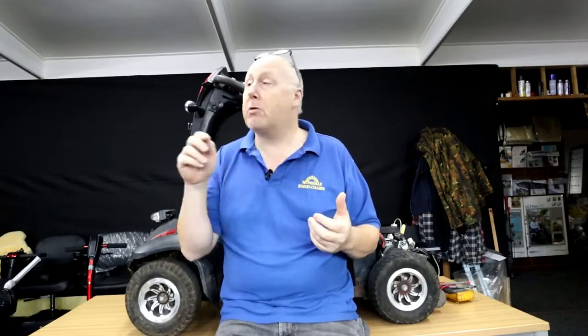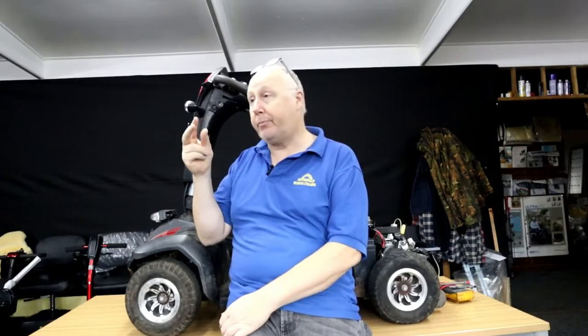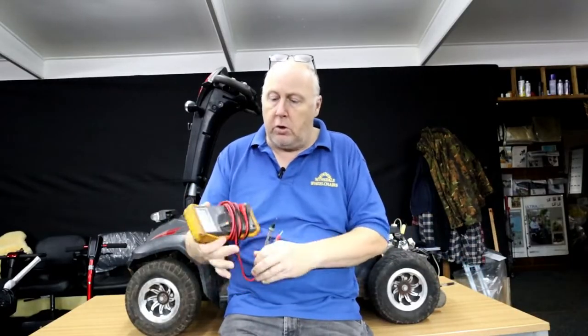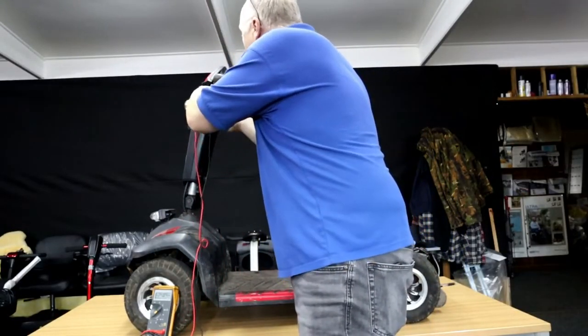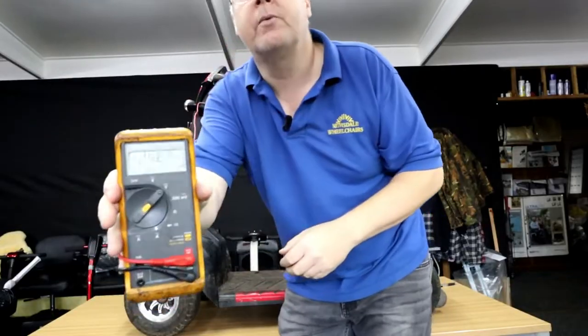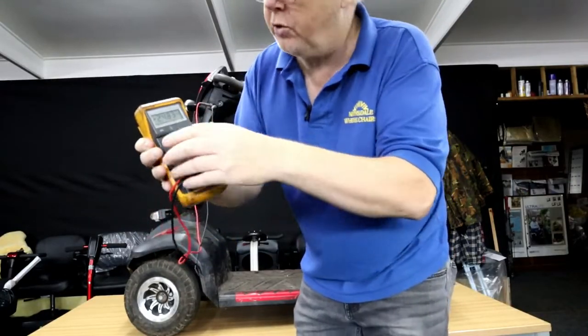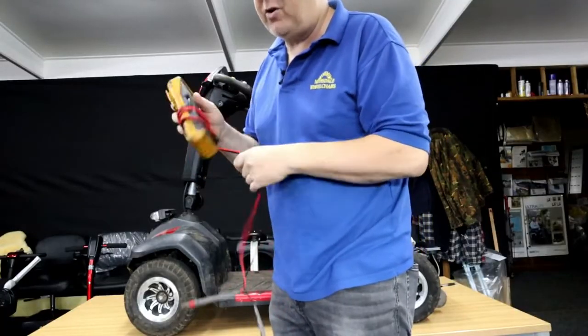My first port of call, especially when you switch it on and there's no power, is to check the voltage on the batteries. I go to the charging point here and use the two outside connectors. I put the multimeter on DC voltage and stick the probes in there. We're reading 24.83 volts - there's a minus on it so I had the probes the wrong way around, positive is on the other side. So we know there's power getting to the batteries and it has been charged.